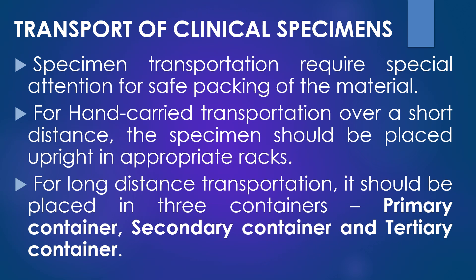The specimens to be sent to other laboratories requires special attention for the safe packaging of the materials. For hand-carried transportation over a short distance, the specimen should be placed upright in the appropriate rack, and for a long distance transportation, it should be placed in three containers.